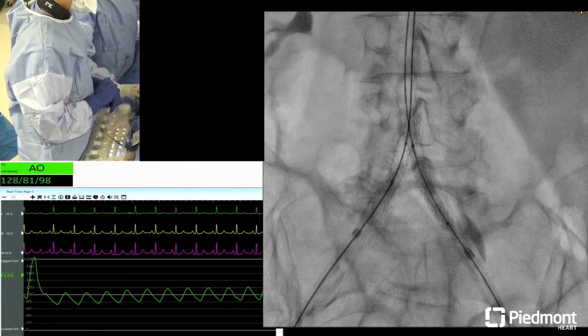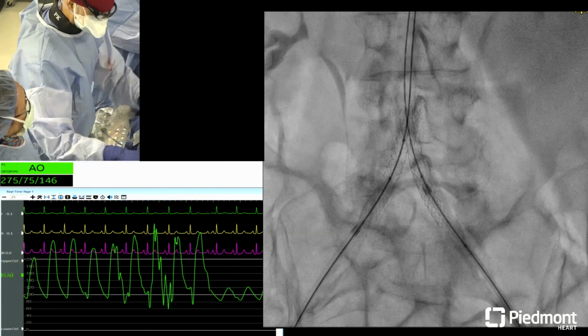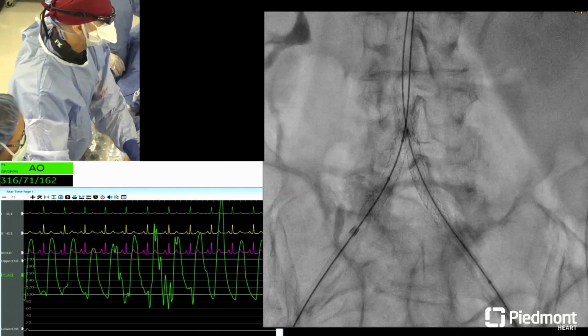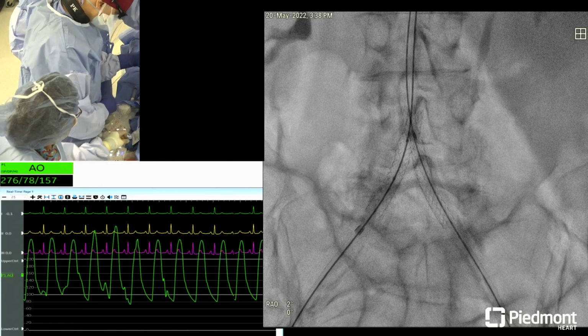We can take a picture here and see what we got. Let's take the balloons back. First, let me just do a little balloon assisted tracking, and that allows us to get up there. Okay. Leave the balloon on. I'm going to take the sheath for me because I'm paranoid about the wire. And then let's take this back a little bit, maybe.